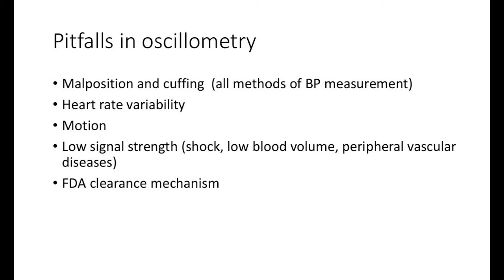Heart rate variability can drive it a little crazy. So when you see atrial fibrillation, for example, I defy someone to tell me what the blood pressure is in a patient with atrial fibrillation, because there is no such thing as the blood pressure. It's the blood pressure associated with that particular length of time in between the heartbeats themselves.